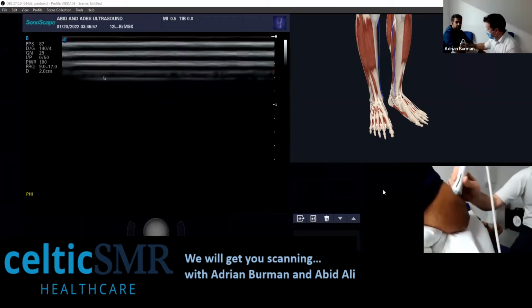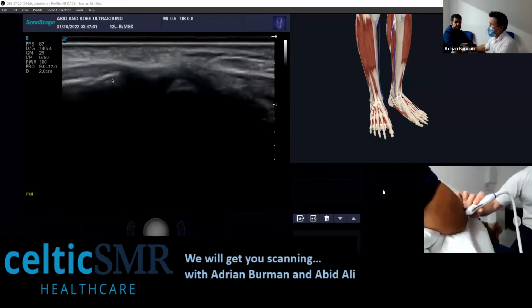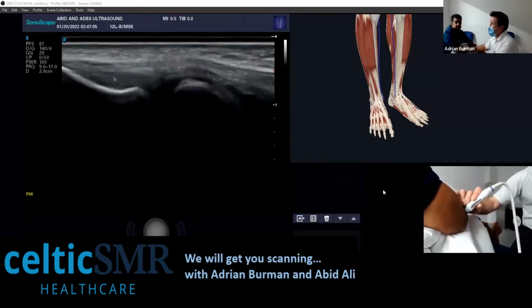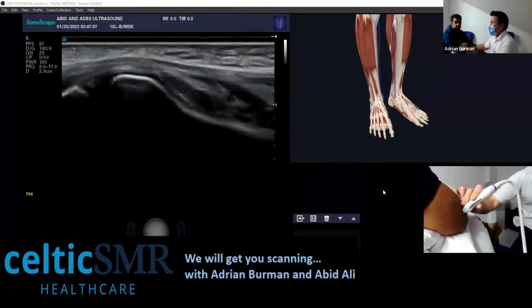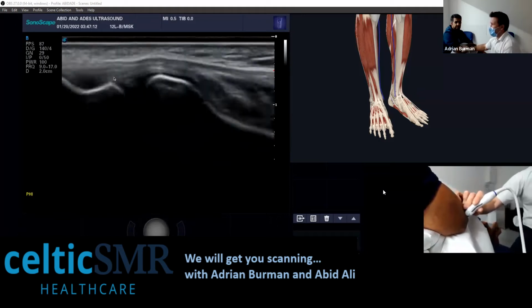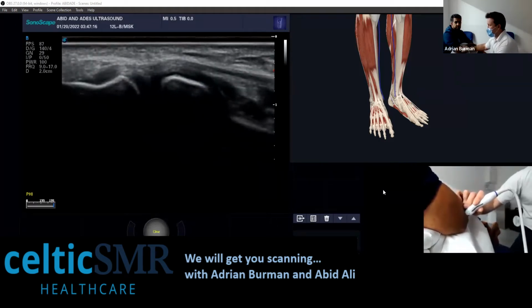Interrogating the joint margin while you're there? Yeah, absolutely. Look at the joints, any effusion, the irregularity. So measure the joint space itself. I probably measure it.